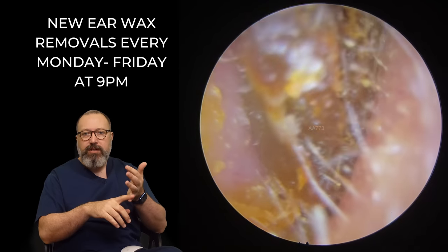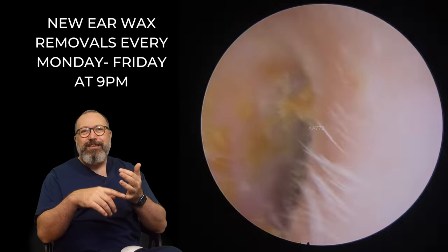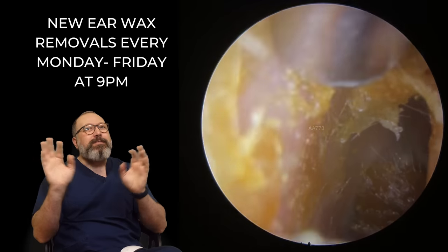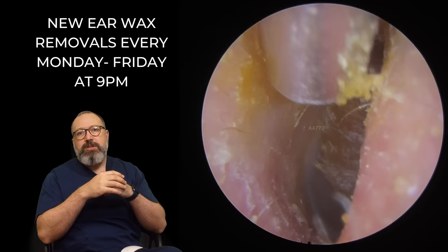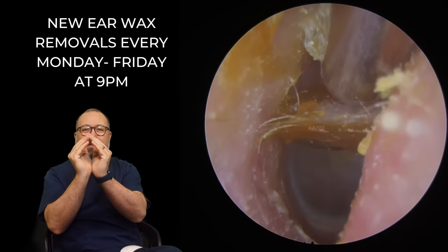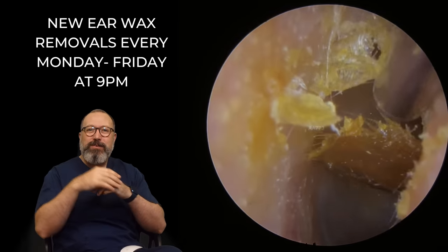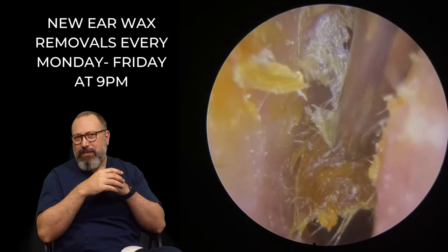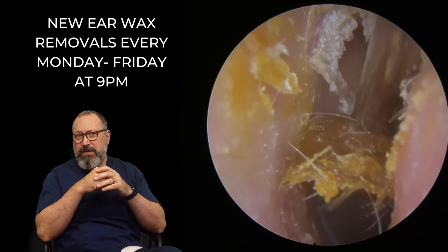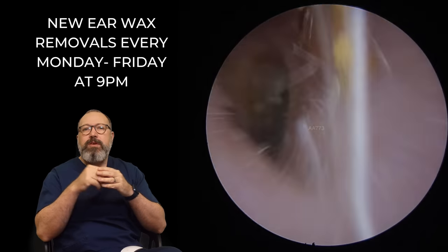My advice to these patients is: if you can use some olive oil on a regular basis, it's really going to help keep things nice and soft. Also come along more regularly because we can get wax out when it's smaller pieces. You can see it's gone all the way down to the eardrum — actually resting against the tympanic membrane right down in that ear canal. We have a bit of a problem because beyond that pinch the piece of wax has formed this shape like a penny — and the difficulty is I've got to get into a gap like that when it's side on. So I'm going to need to try and flick this somehow in the most sensitive part of the ear, trying not to just yank it through as that would be really uncomfortable for the patient. If I can just turn it — there we go — now if I can flick it from the side we should be able to lift it. And there he goes, all the way through.